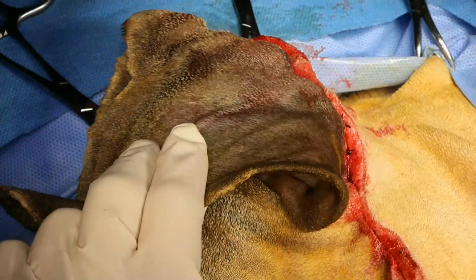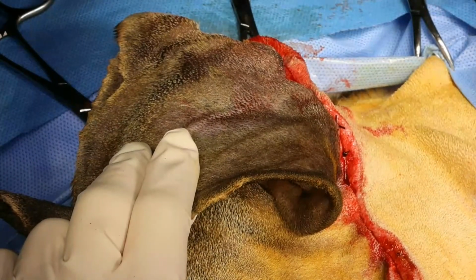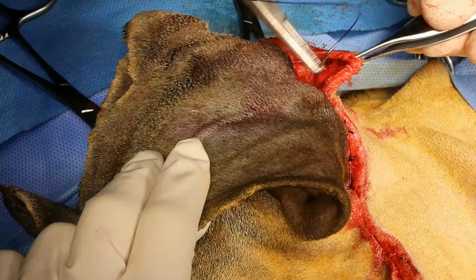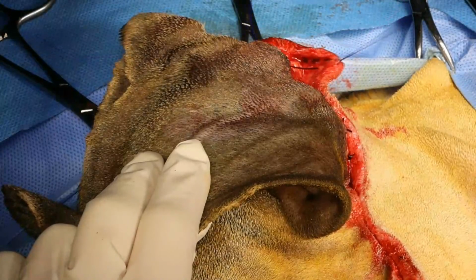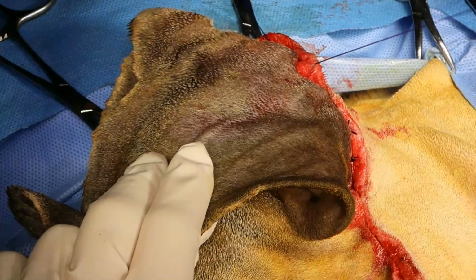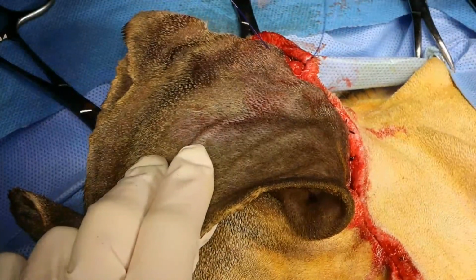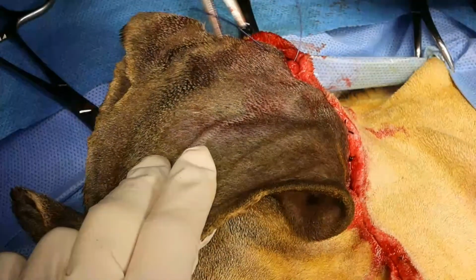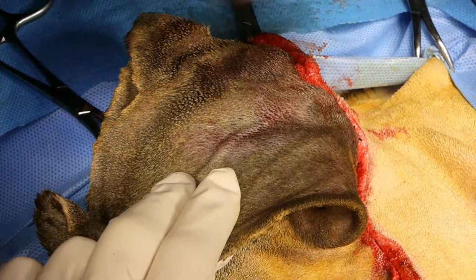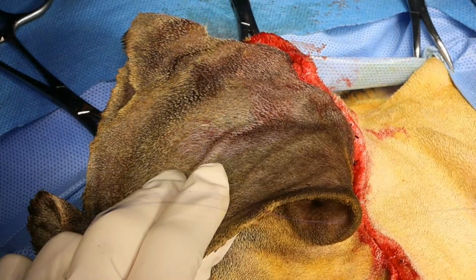Thank you. Are you happy to do an intradermal on this? I will probably not put any kind of bandage on this.